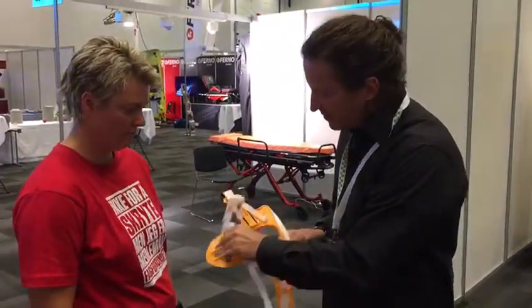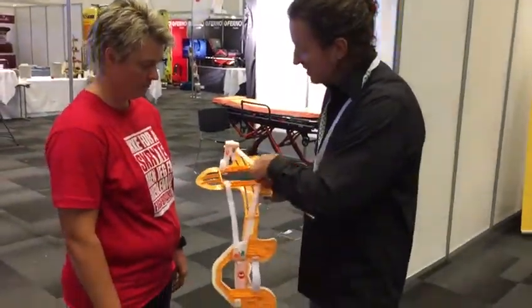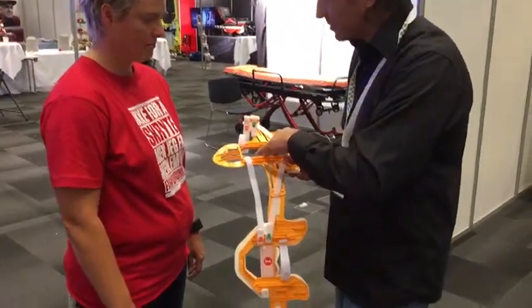We deploy the device and extend the back piece. The new back piece is light and provides big access for doctors to check the patient in the emergency room.